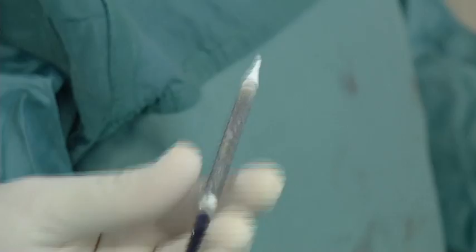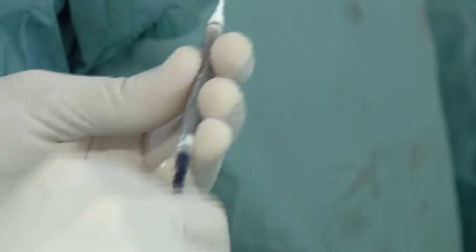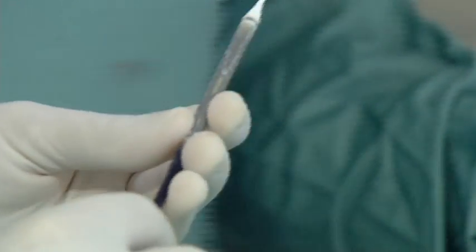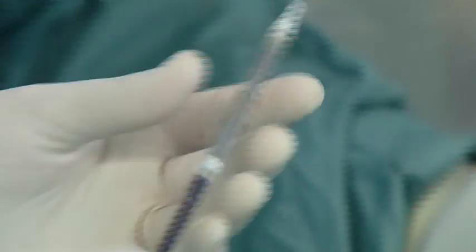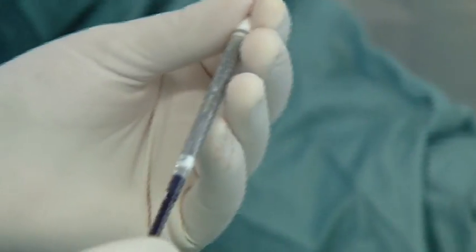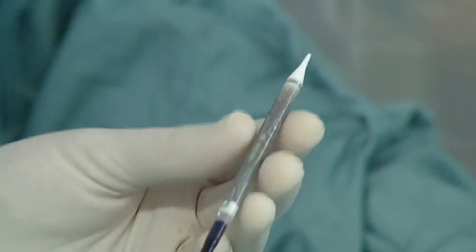Most of the shaft is a 12 French device. The tip is approximately 18 French, and this is the reason we need an 18 French sheath.